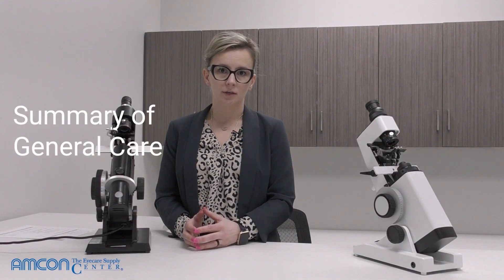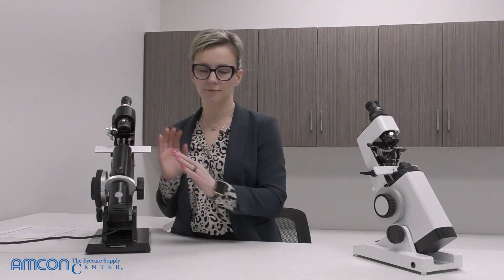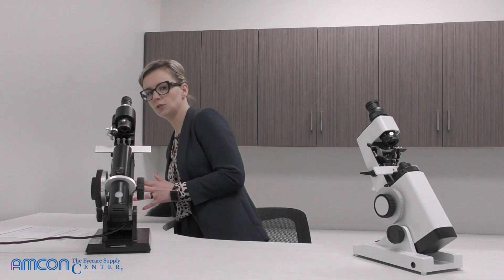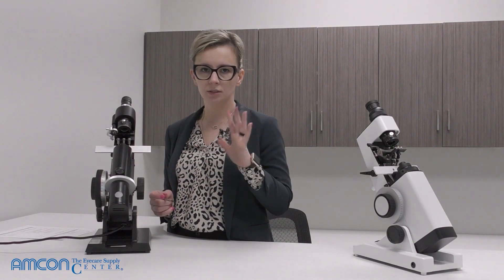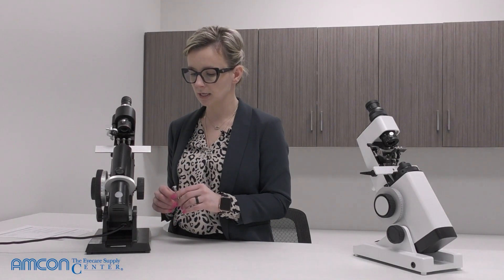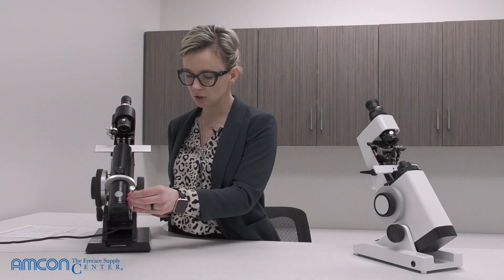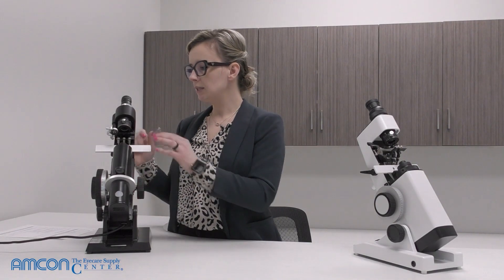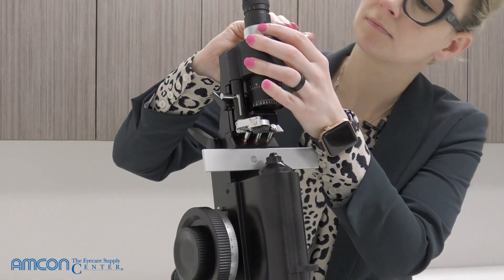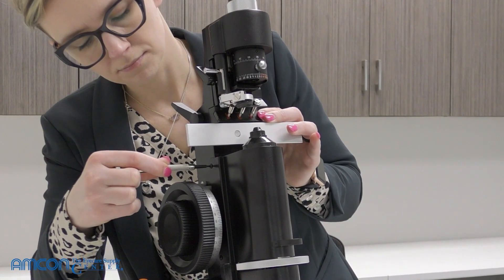To sum up general care of a lensometer — and this applies whether you're using the 6024 or the 6405 — periodically check that all of your screws are nice and tight. You'll find screws all around the lensometer. The ones most likely to loosen over time are the ones around your eyepiece, your lens stop, and the plate. Any of the other screws should not loosen up.